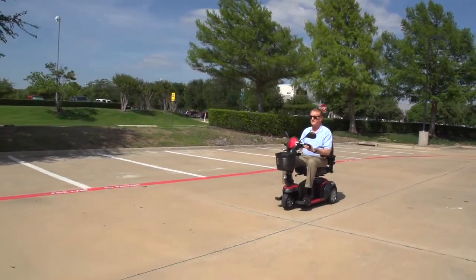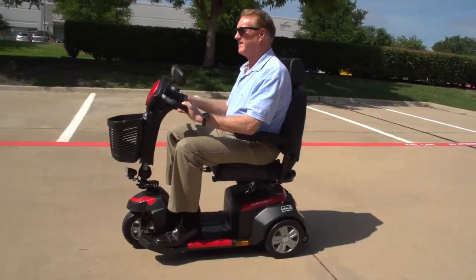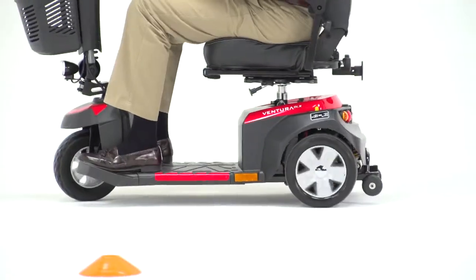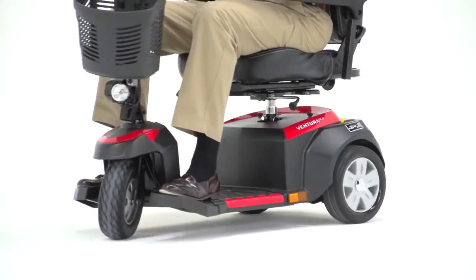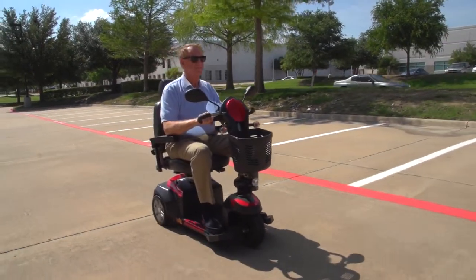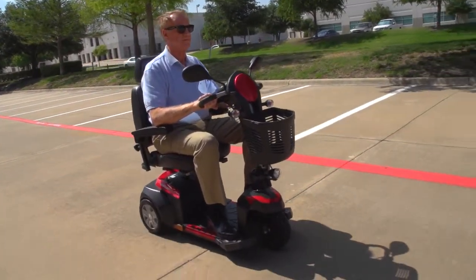With the Ventura 3-Wheel Deluxe version, you get great maneuverability in tight spaces with a 53-inch turning radius and an extended footboard, which benefits taller riders. Its 22 miles of travel range make the Ventura great for trips around town or around the neighborhood.